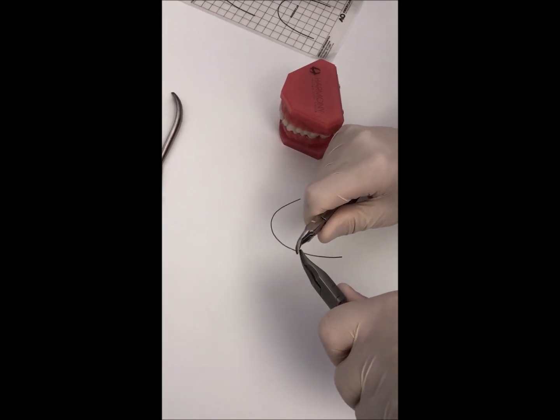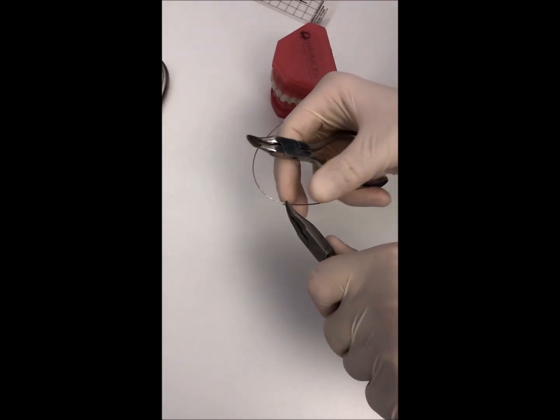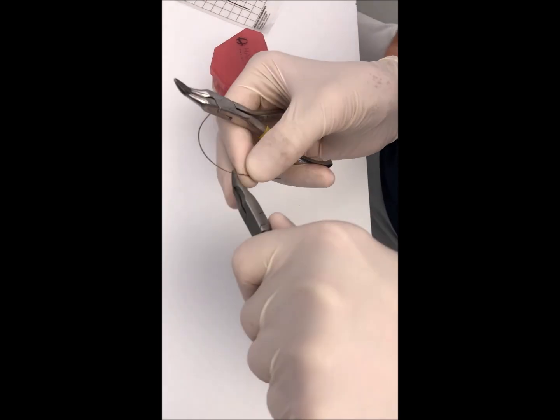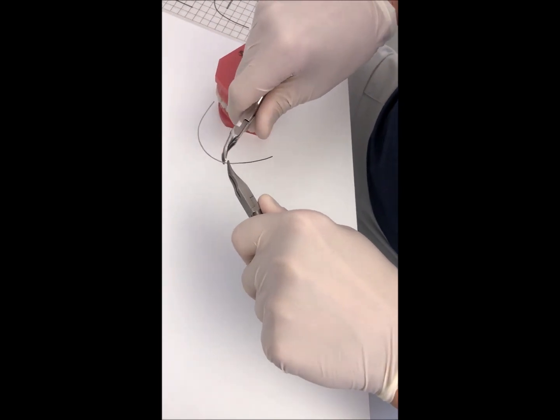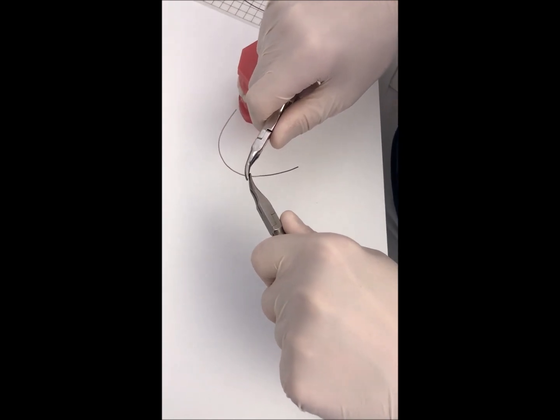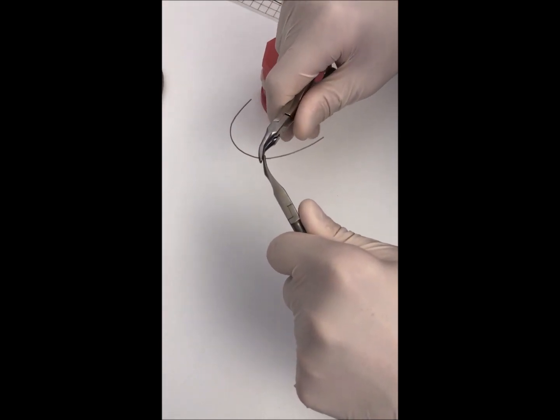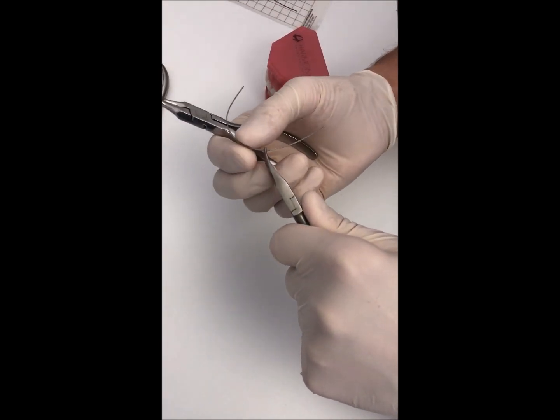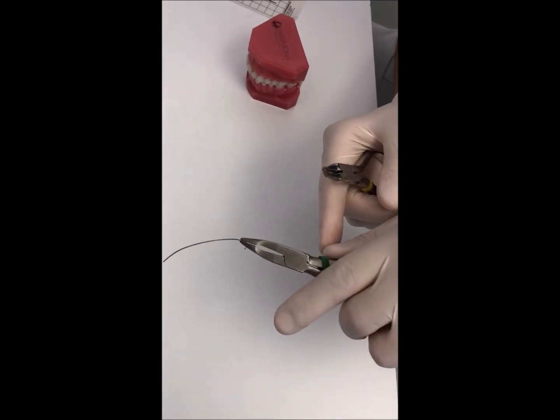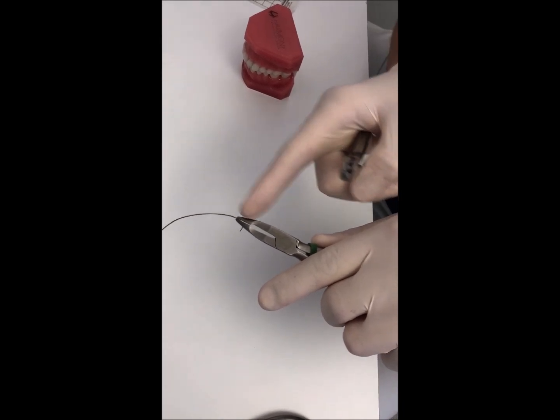This is the position of the bracket of tooth 33 and we want to go lingually with the root. So first of all we do this, and then we go to the mesial part of the wire going out from the bracket and we put the wire on the same plane. This is the activation. We can check the amount of activation — it is the angle, the corner between the plier and the wire.